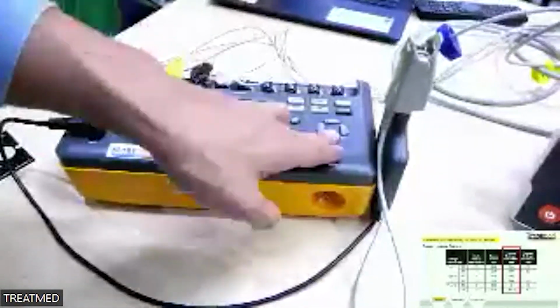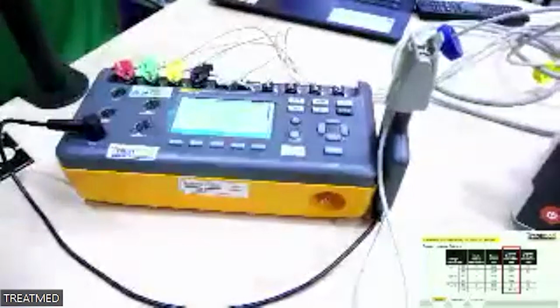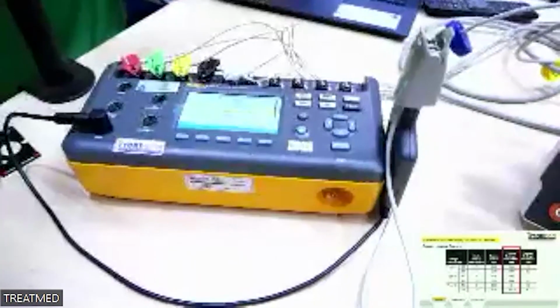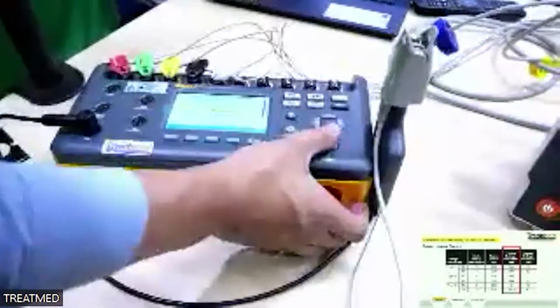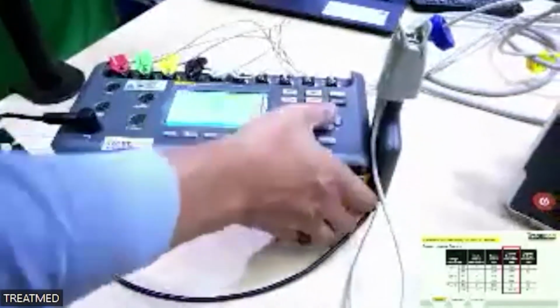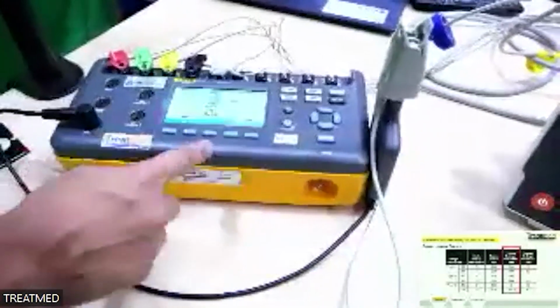When we test the SPO2, we must choose the type and brand correctly. In this case, we use the Nellcor brand.